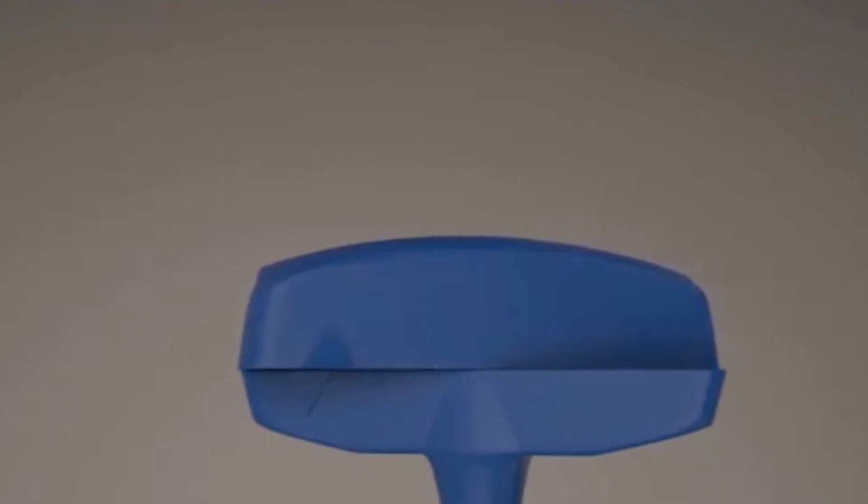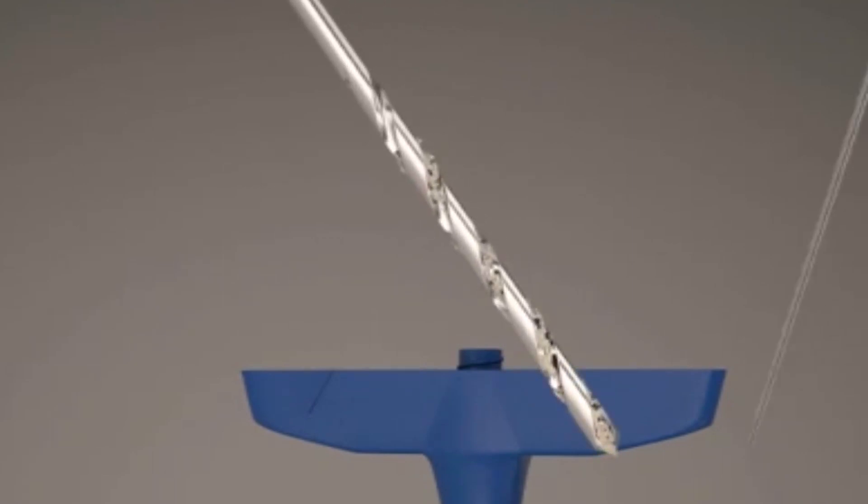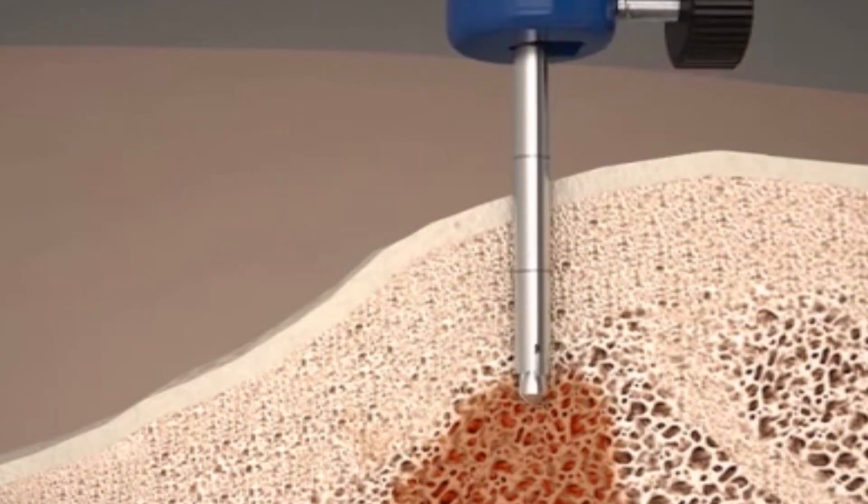If penetrating multiple centimeters of cortex, it may be necessary to withdraw the drill and clear the grooves of bone debris with a sterile needle. This debris can be collected as secondary specimens. The tip of the cannula is delivered past the cortex to the lesion margin. The position is verified under imaging and the drill removed.